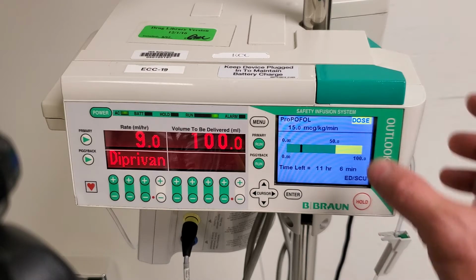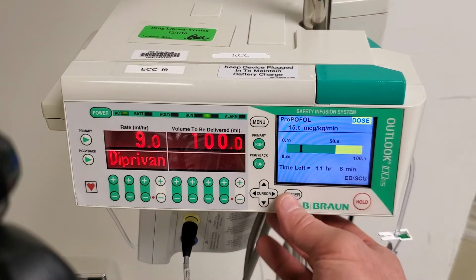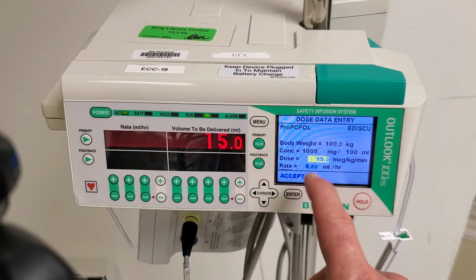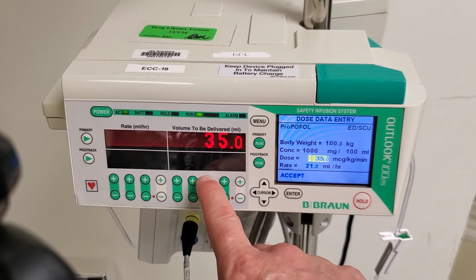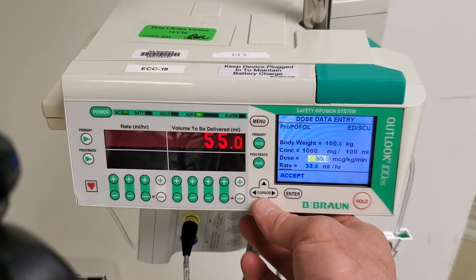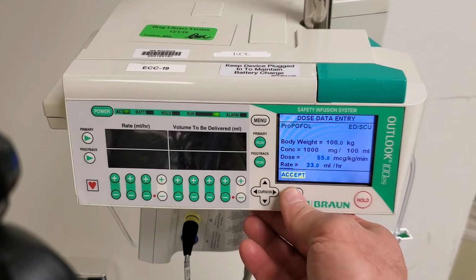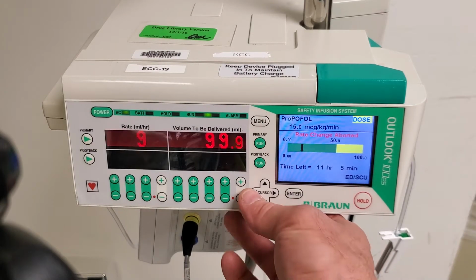The other way to make a dose change is, notice that dose in the upper corner here is highlighted. We can select that, and then we can enter whatever our rate is. Let's go to 55. This will show you what the soft limit looks like. The value is outside the allowable dosage limits. Do you want to continue?